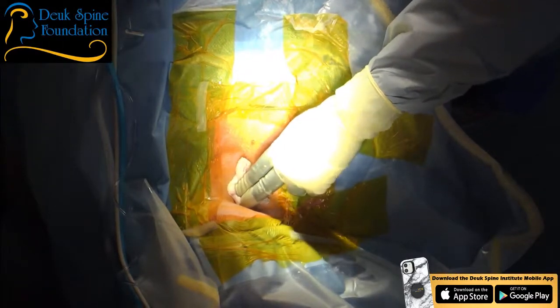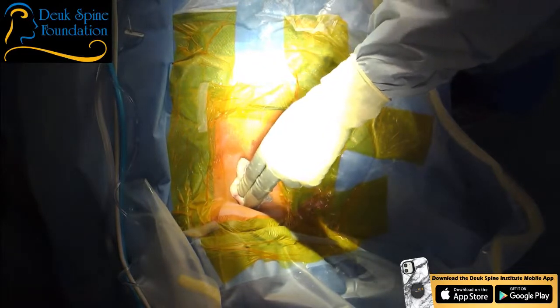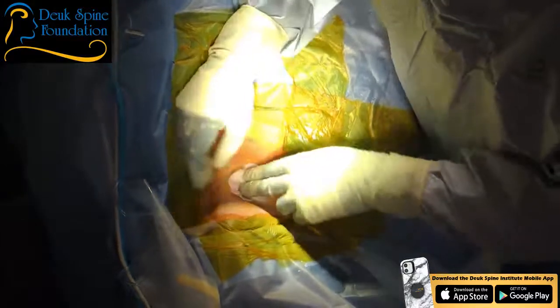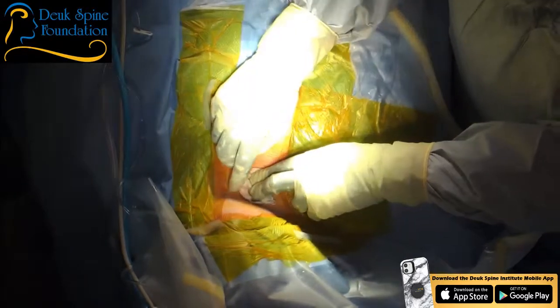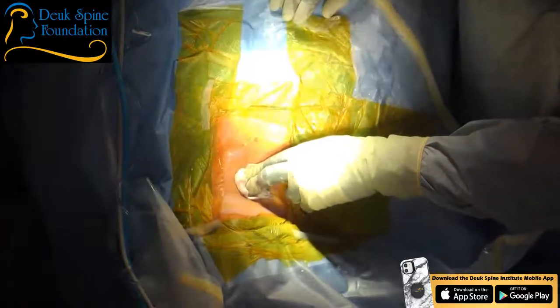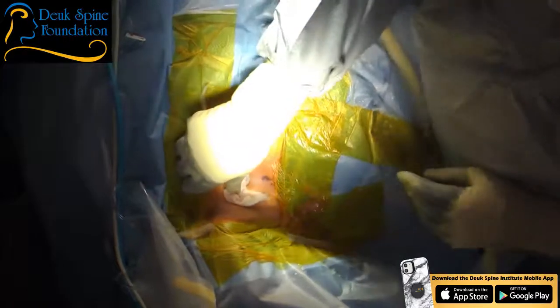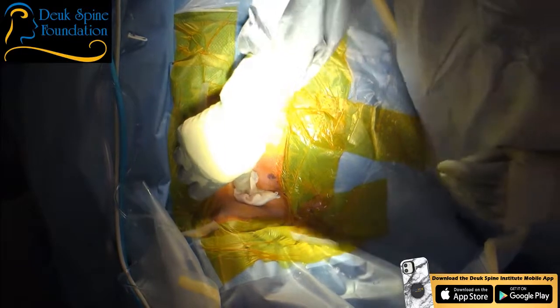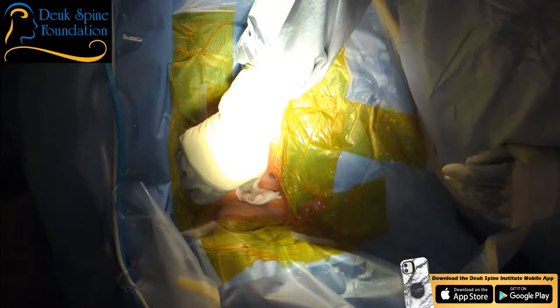Veins are low pressure blood vessels. They only have 10 millimeters of mercury in them. That's the pressure of the blood in a vein. So if you push against it by 11 millimeters of mercury or even 10, the bleeding will stop. Arteries have whatever your arterial blood pressure is. What is her blood pressure? 100? So for me to stop an artery from bleeding, I have to push 100 millimeters of mercury. That's 10 times the amount of pressure that I apply for a vein. So to stop a vein from bleeding, it's 10 millimeters of mercury. To stop an artery, it's 100.